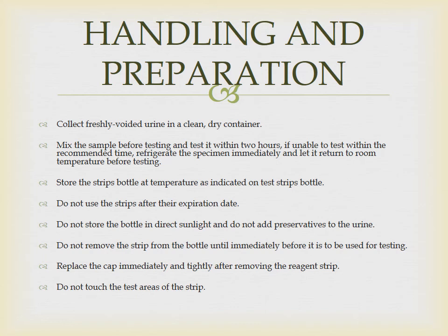Store the strips bottle at the temperature indicated on the test strips bottle. Do not use the strips after their expiration date. Do not store the bottle in direct sunlight, and do not add preservatives to the urine.